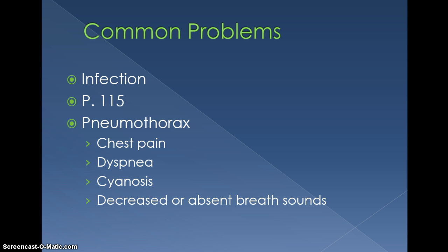You can fix them externally, like I said. You can retape or try to position it so that it's proper. Remove any loops or kinks that there are, so that it doesn't cause any other problems.